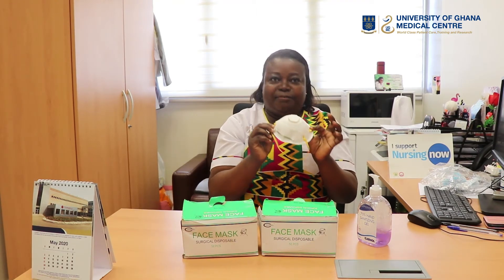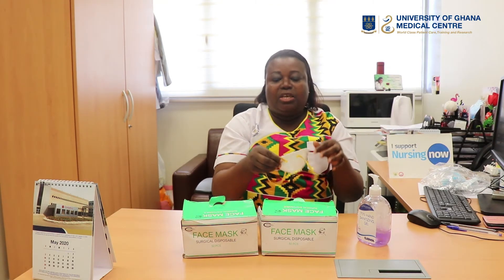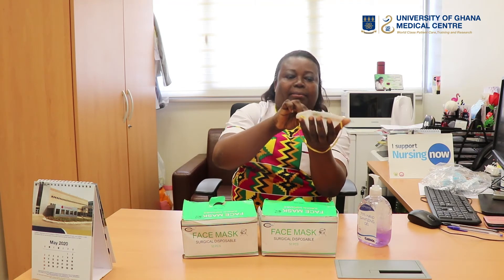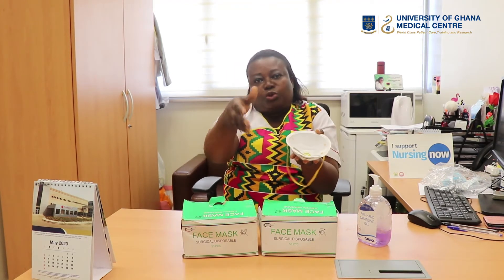The next one I'm going to talk about is the respirator, also known as the N95. I sanitize my hands and I pick this mask. Before you wear it, you have to locate where the string is and let it face outwards. You will then let the rubber loops fall off and place the mask into your palm like this, with the string facing outwards.